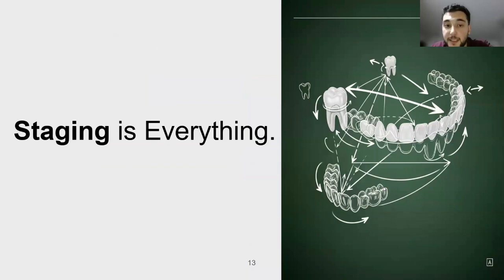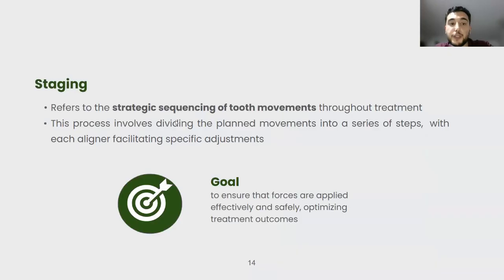So that's it for predictability. Moving on to staging, it's important to understand that staging refers to the strategic sequencing of teeth movement throughout the treatment. This process involves dividing the planned movements. We don't want all of the movements happening at the same time.